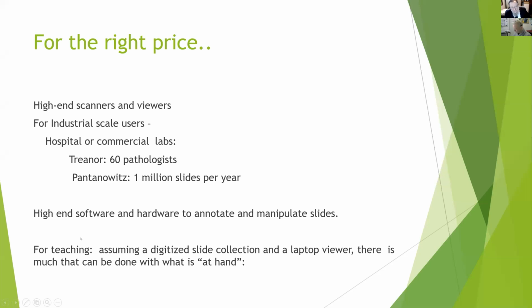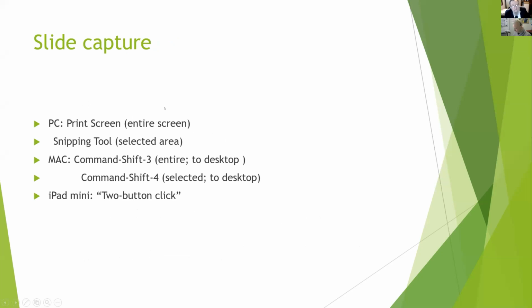On the other hand, for teaching in a classroom, given that, as I said, you have a digitized slide collection, a laptop viewer, that's the beginning of the story. Now the question is, what can be done with what is at hand? First of all, slide capture. And what this shows, and I'm going to go through this format in multiple slides, whether using PC or Windows system, whether using a Mac, Apple system, there are various simple commands, either built in or an app that you can easily download to save the image.